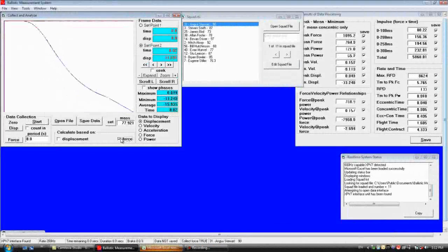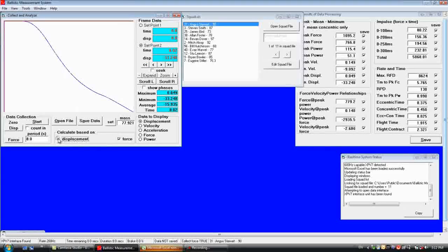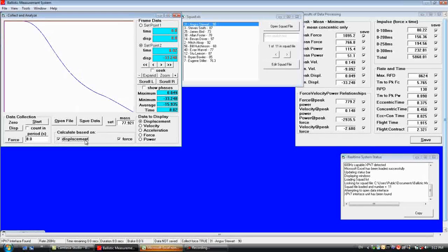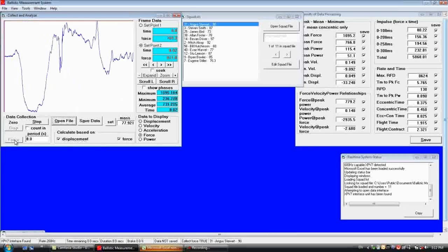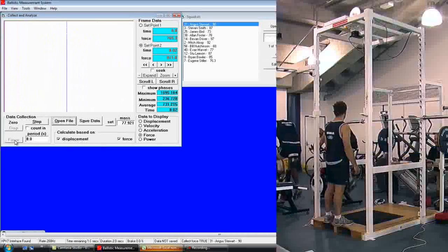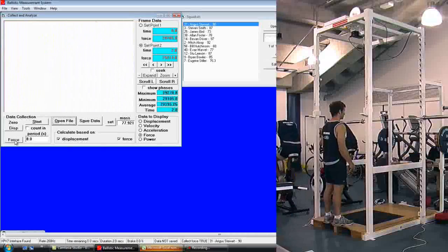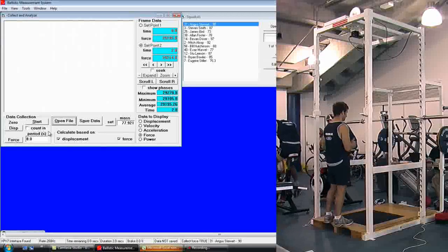First off, we go into Calculate Based On and check Force and Displacement, and zero the force plate with no mass on the plate.